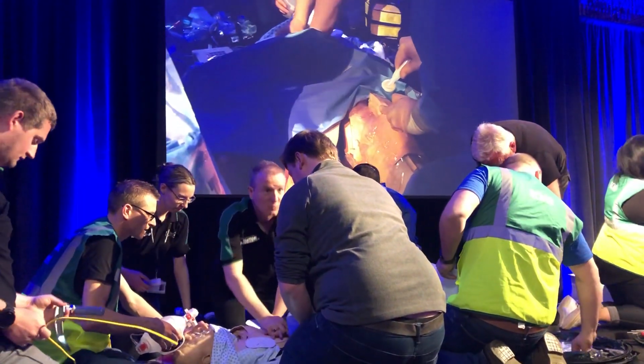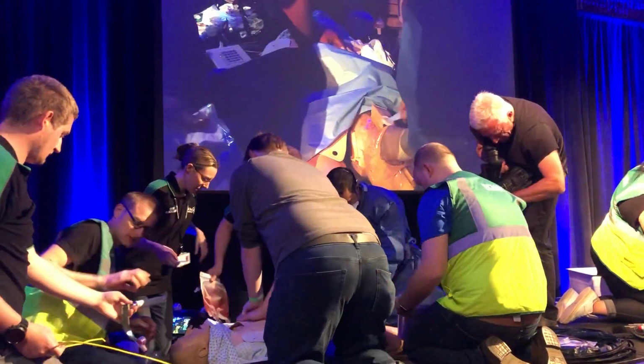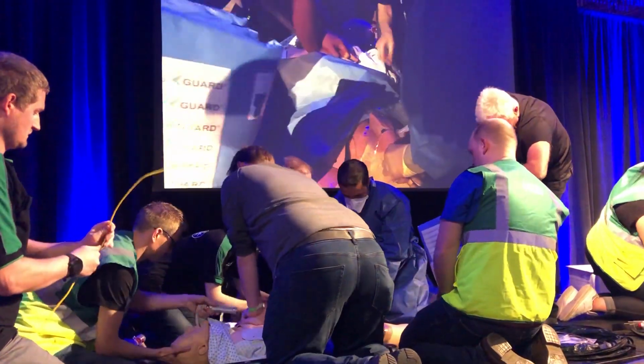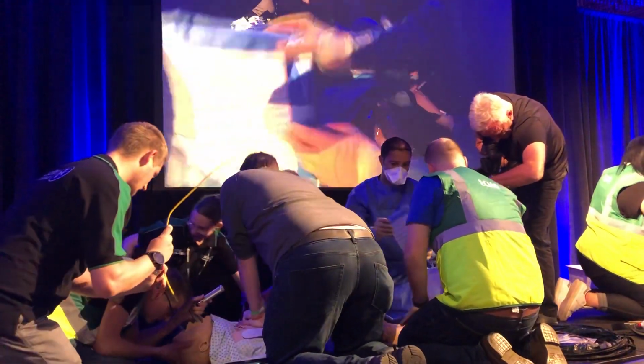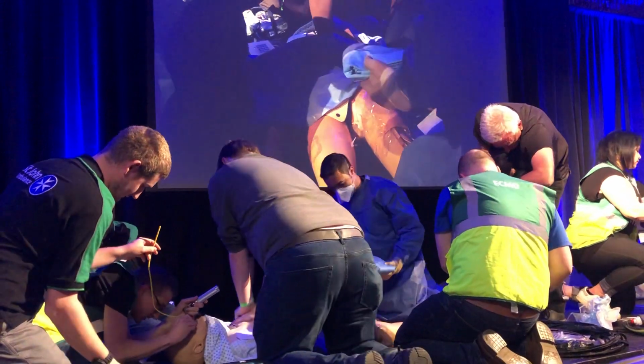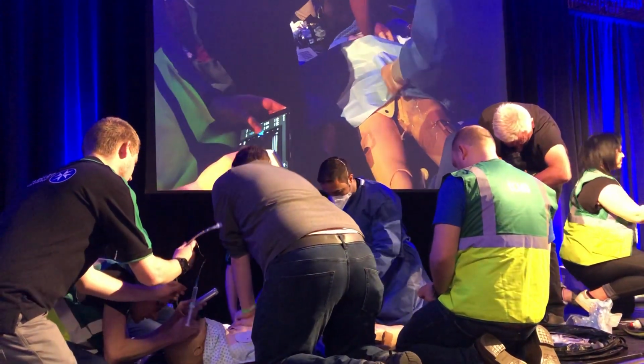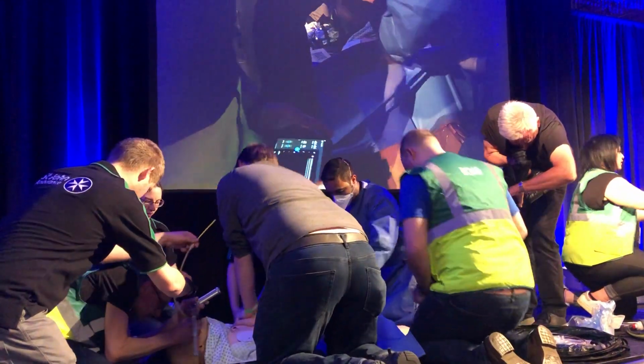But all we're doing at this stage is putting wires into the femoral vein and the femoral artery. And we're doing it percutaneously, just like we would a central line and an arterial line. And to be honest, if you've had a cardiac arrest, even if you ROSC, you're going to get an arterial line. Okay? And if you get a good ROSC and the patient sits up and goes, what's going on? We just pull the wires out.